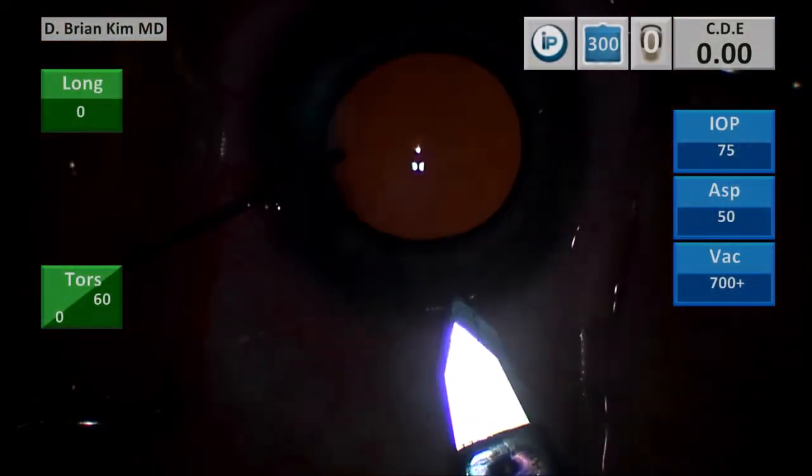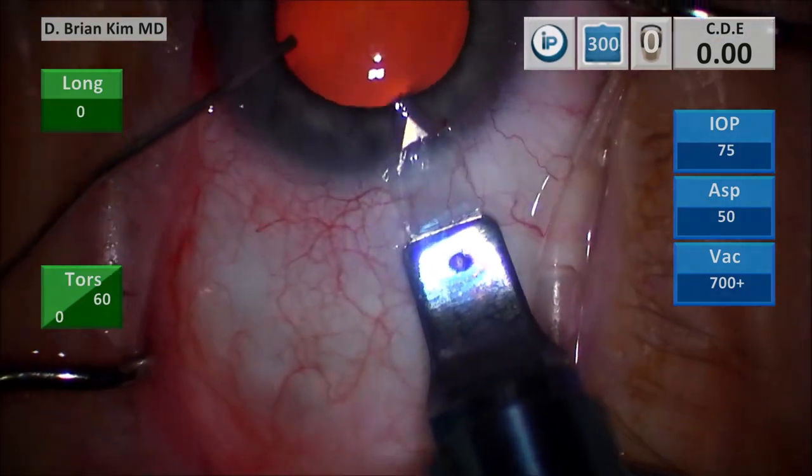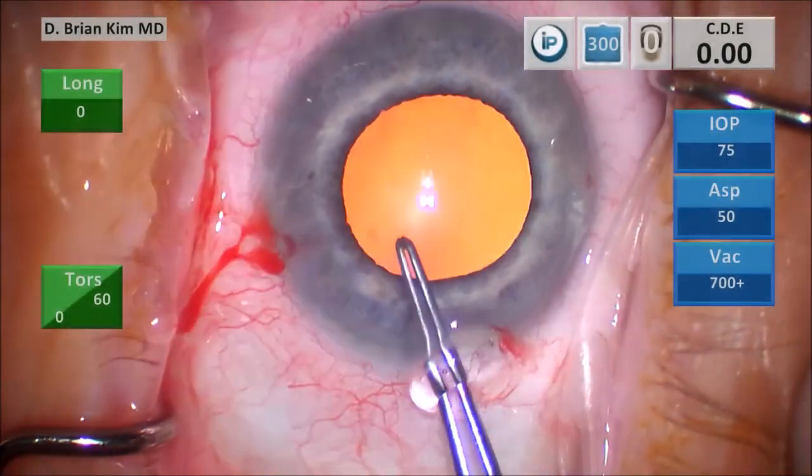I make a vertical groove, go into the groove, and then tunnel through the cornea. And then when I'm ready, I dive down and enter the anterior chamber. This is my triplanar corneal incision, and I'm doing this with control of my cannula.